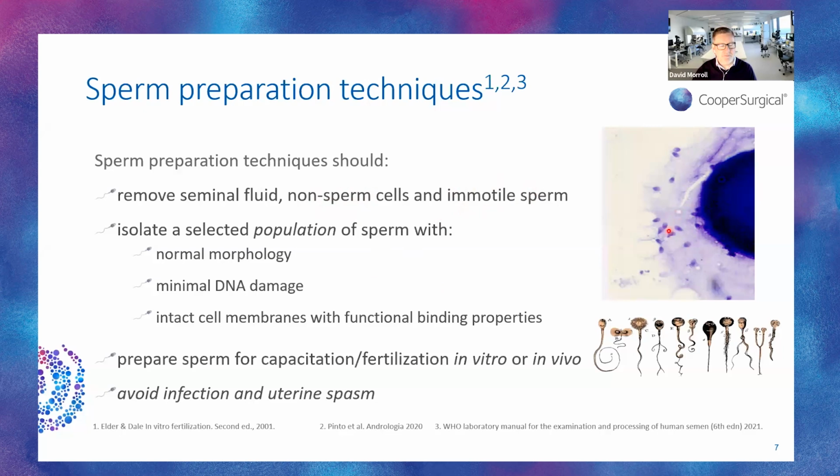You can see here a picture of a failed to fertilize human oocyte where the zona pellucida has been expanded, and we've stained up the cells. You can see the sperm adherent to the outside of the zona, and they show a much, much better morphology than you see typically in a prepared sample and certainly in the raw semen. So it's clearly morphology based.